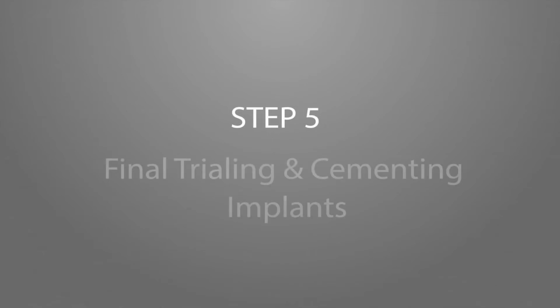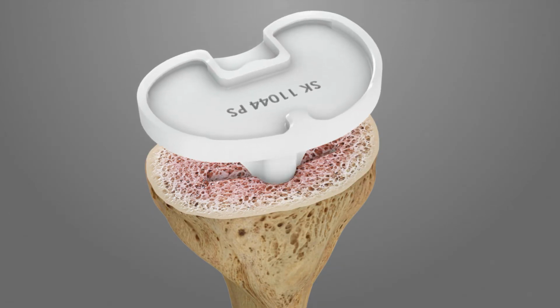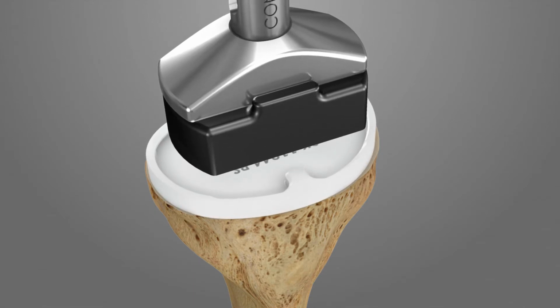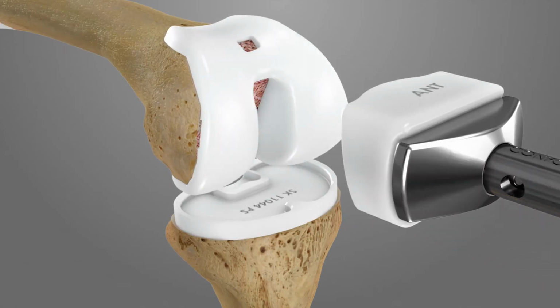Step 5. Final trialing and cementing implants. Prior to cementing, an additional trialing step can be performed using the femoral trial in conjunction with the trial inserts and the tibial tray trial. Install the tibial tray trial by manually inserting it and then gently impacting it into place using the tibial tray impactor tip. Using the femoral impactor tip, impact the femoral trial on the femur.